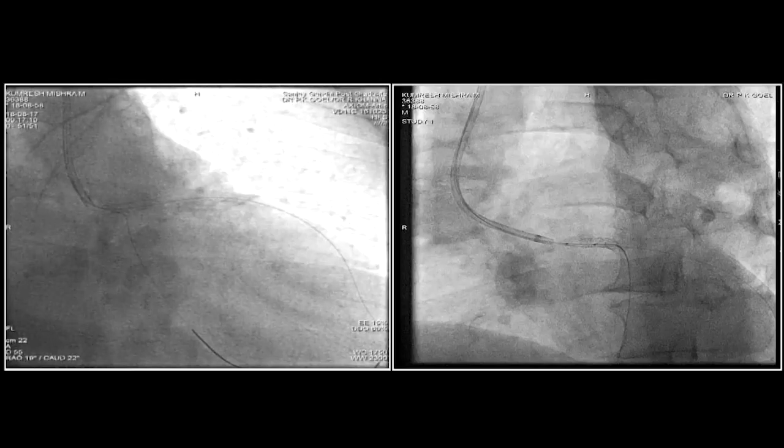Well, at this stage, I can also rewire the circumflex. There is no issue. I think we can do the rewire first, sir. No, let me rewire the circumflex. Can you give me a few wires? Actually, before we do the POT, I'll rewire the circumflex.